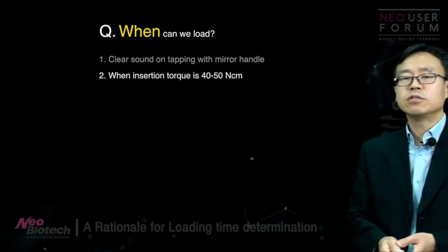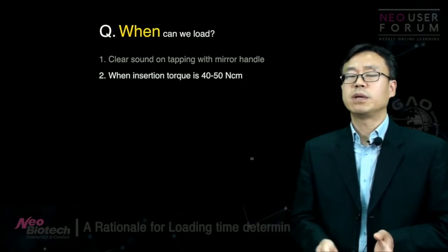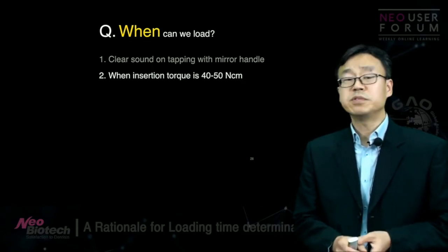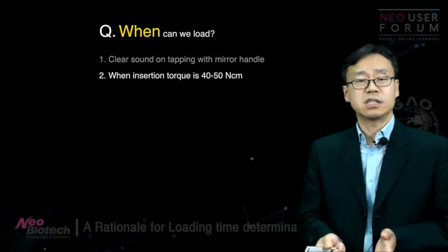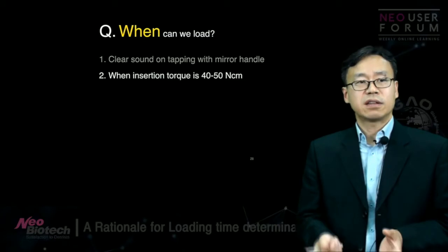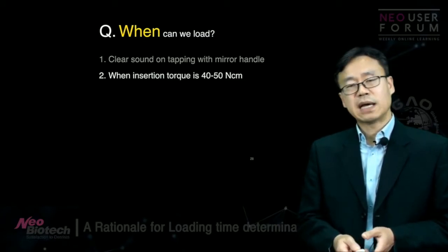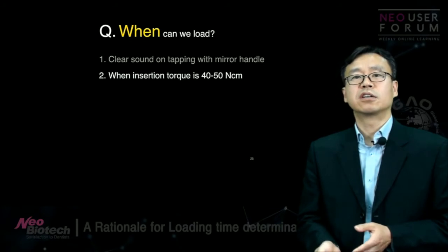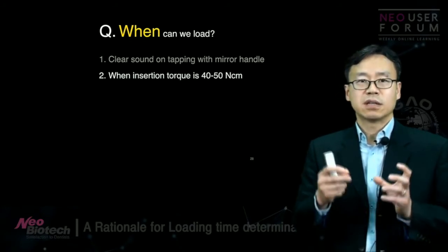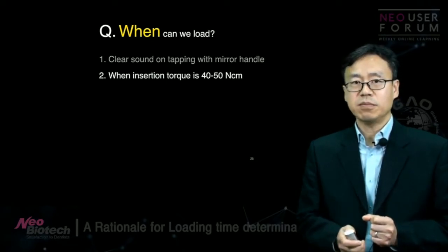But some people use insertion torque instead. I know many people use somewhere between 30 to 50 or even up to 60 to think that the fixation is good enough. I don't know if it's good enough for loading, but they want to have high insertion torque when they place their implants.